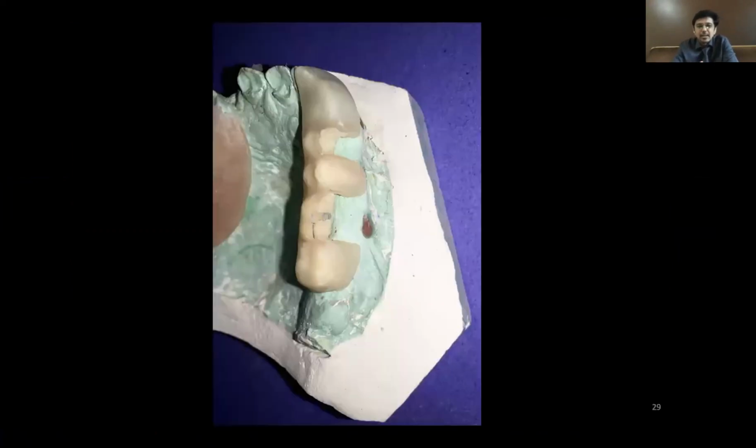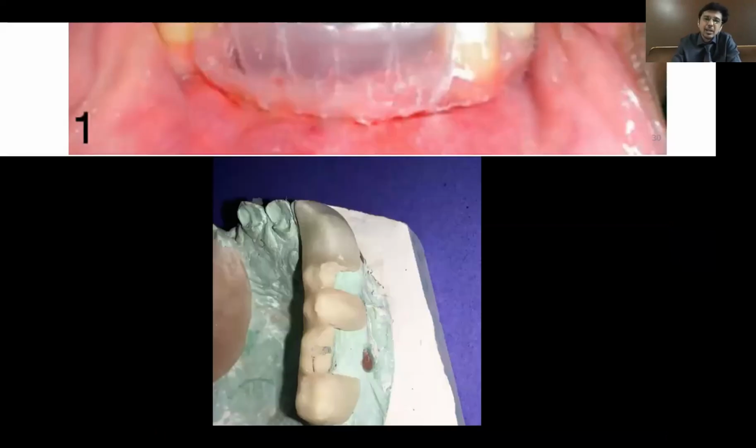Again, this is not of much use with regard to single tooth, but whenever you are placing multiple implants, trust me, no matter how expert we might think we are as an implantologist, always and always go for a surgical stent with regard to multiple teeth placement. Okay, so multiple teeth, first thing.